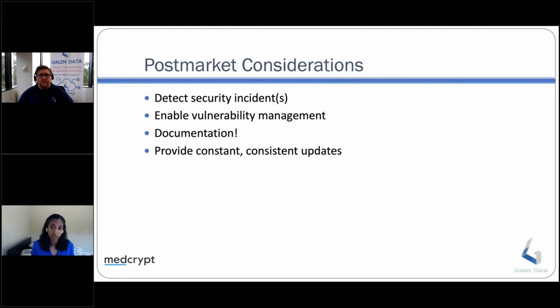So I think this is partially why vulnerability management, or the idea of even knowing what's inside your software and keeping track of it for vulnerability disclosures, has gotten so much airtime in the last year and a half. Biden's executive order last summer, the DoD, the VA, all these entities basically saying thou must be transparent in how your software is built and what's in it, and tell us when something happens, has really gained a lot of momentum. Now, right or wrong, I know there's a lot of drama around SBOMs in general, but the idea of actually tracking it and knowing if you're impacted is precisely why things like WannaCry are so problematic.